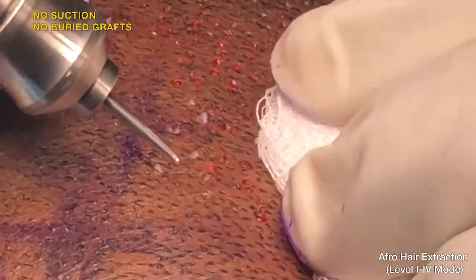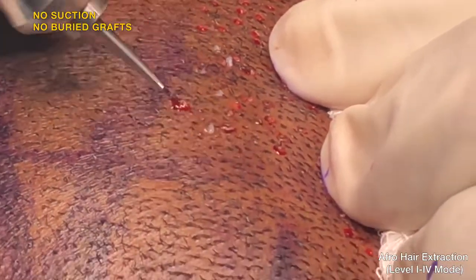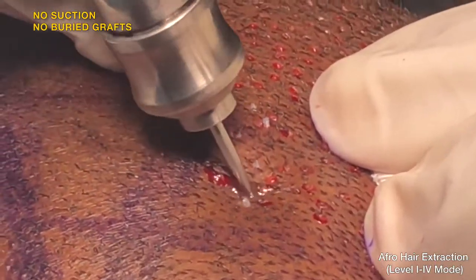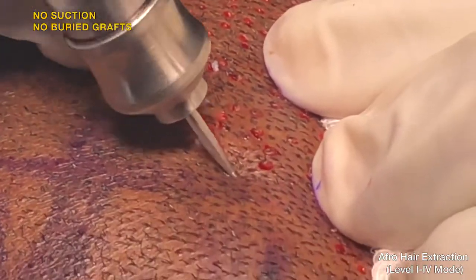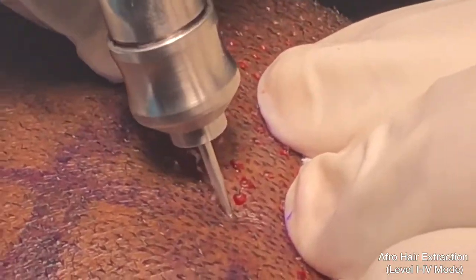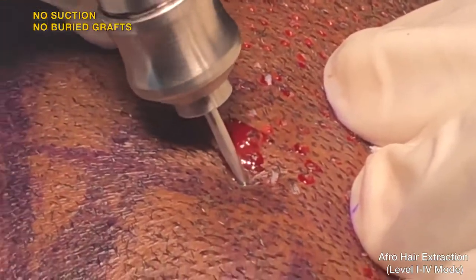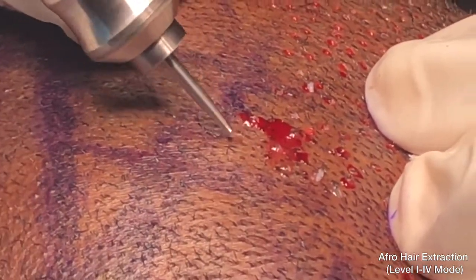The punch is self-navigating; there is no need to manually guide it. The hydration system lubricates the punch tip and graft. There is no need to try to guess and manually navigate the angle. Let the Dr. U Graft and the intelligent punch guide itself.